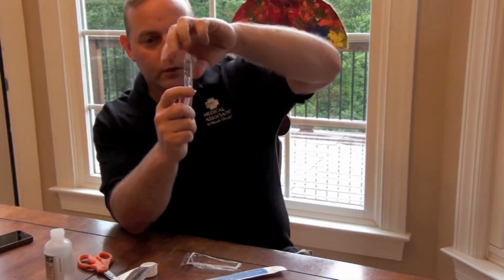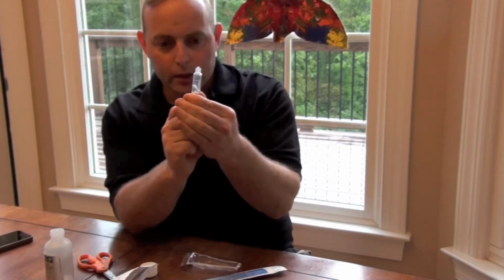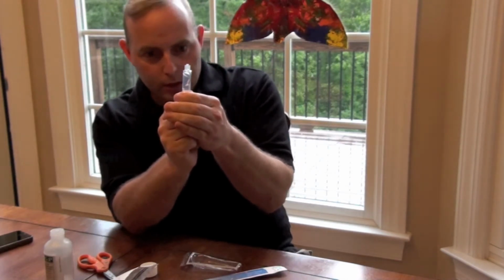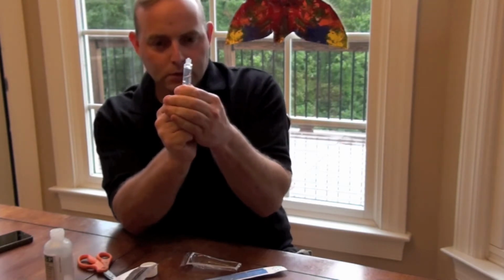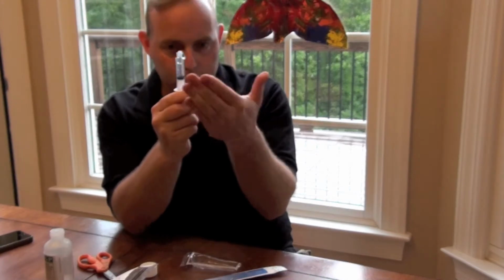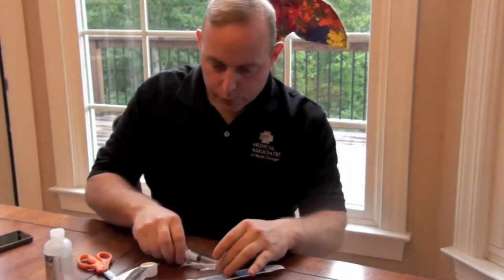Invert so the lidocaine doesn't squirt out the luer lock end. And then once it's away from the luer lock end, you can gently pop it into place, because if you push too hard, you'll see it just squirts out like that. So it can be a little messy.